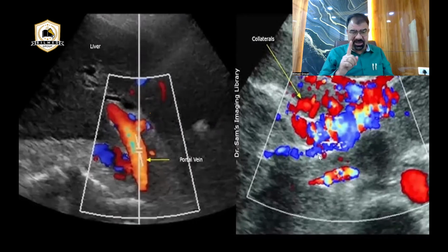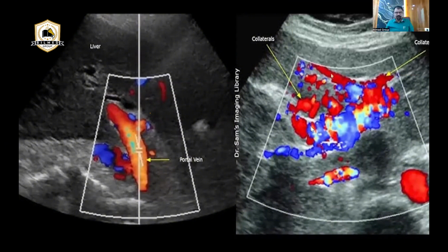You have to go to the trackball, and by scrolling down, you will see that the box size starts decreasing from here as well as from here. And by scrolling sidewise, left or right, you will see that it is shrinking this way. So your trackball is actually the control to increase or decrease the color box size.